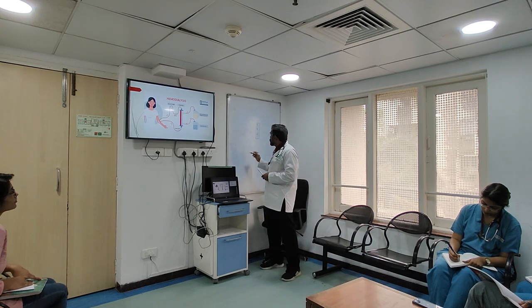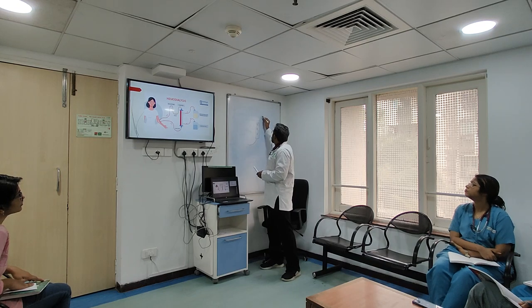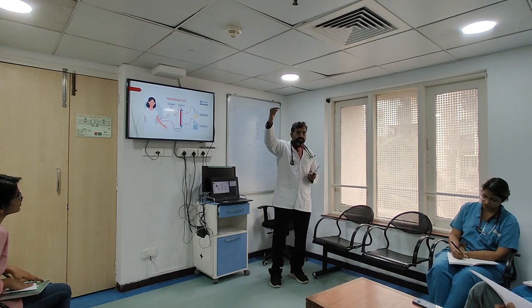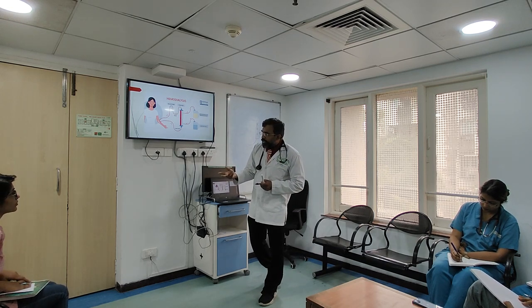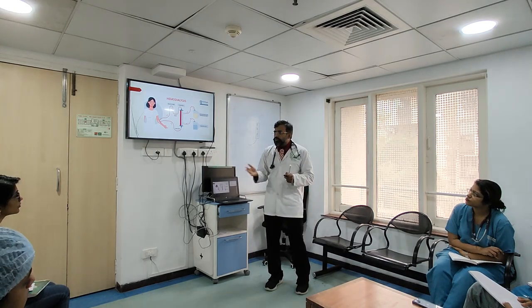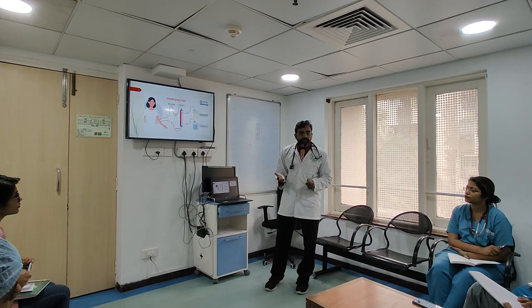Now importantly, the blood is going from here, whereas dialysate is going from here. So if you look at it, blood is coming this way and dialysate is going this way. This is called counter current. You understand? Counter current. Now can you tell me why this is so? Why do you want to give it counter current? After all, you just want things to approximate between two sides, right? Vidya, why do you feel you should give it countercurrent? What is the reason for being countercurrent?